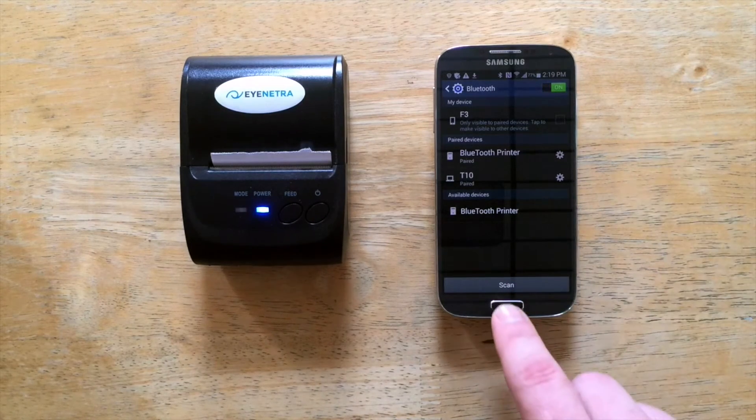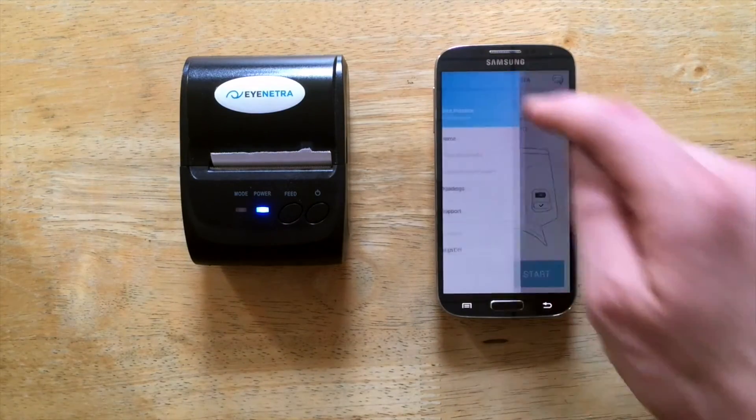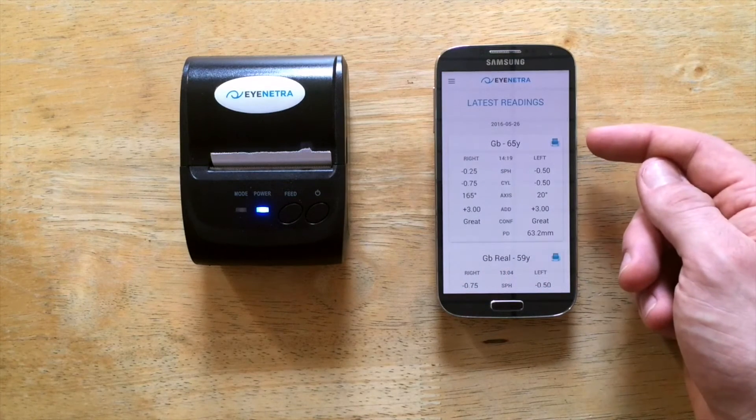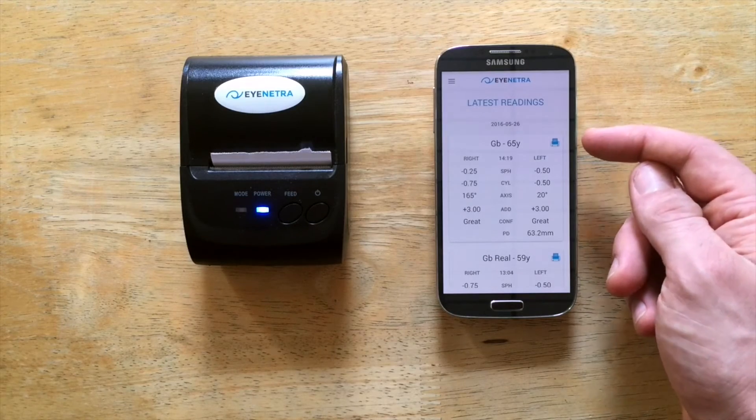So to print my results, I'll go back to the home screen, select Netra, select the drop-down menu, open up my readings, and you'll notice a blue printer icon now appears here. To print the readings, simply tap the icon.